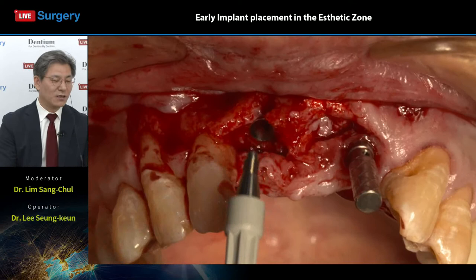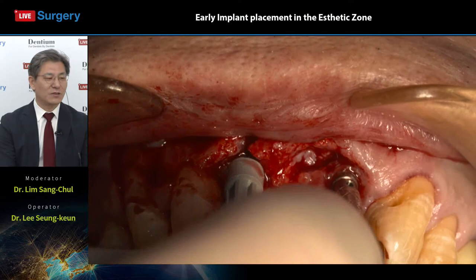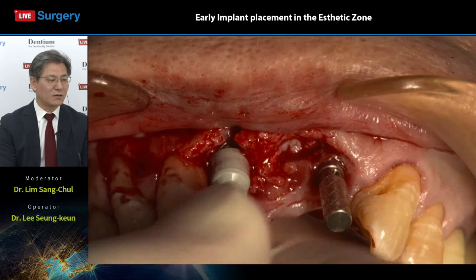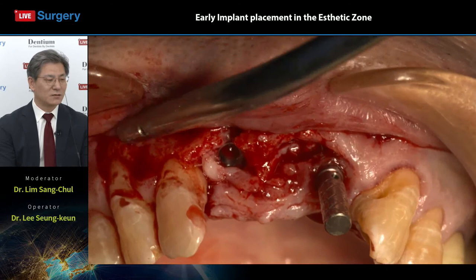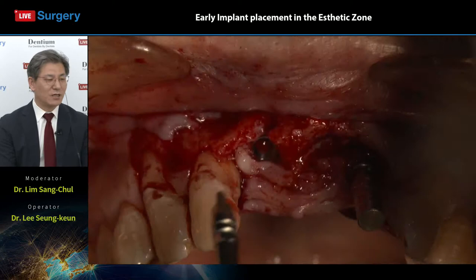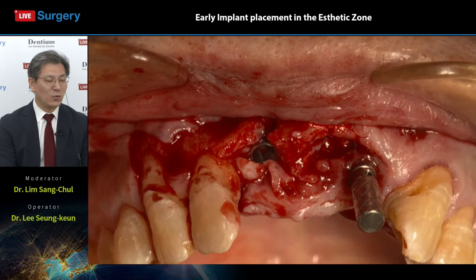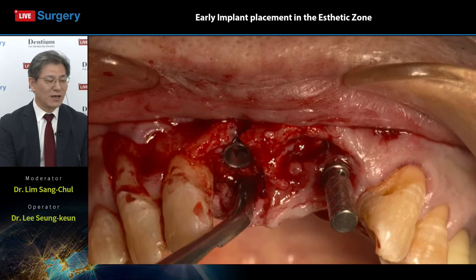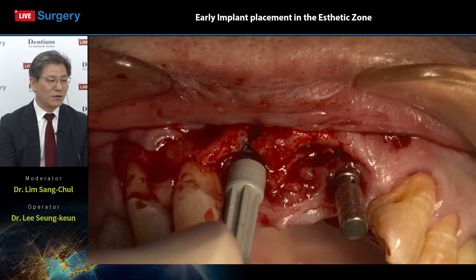Now he wants to use a GBR abutment with a titanium plate for holding the bone graft material. There is only one size of GBR abutment. The gingival height is just 2 millimeters. A GBR abutment has a 2 millimeter gingival height, and I want a more shallow one. So he slightly retrieves the implant position because of connecting with a GBR abutment, right? The GBR abutment has only one gingival height, 2 millimeters. So for the proper connection, Dr. Lee slightly retrieves the implant fixture for the proper connection with the GBR abutment, right?